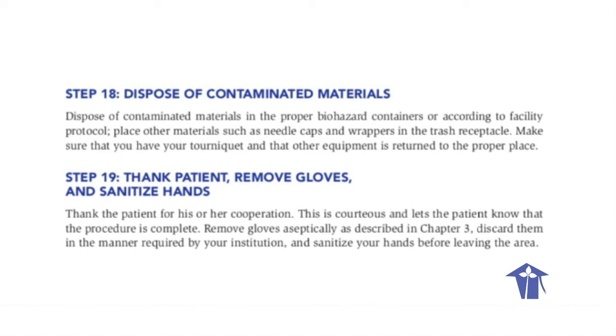Step 19. Thank patient, remove gloves and sanitize hands. Thank the patient for his or her cooperation. This is courteous and lets the patient know that the procedure is complete. Remove gloves aseptically, as described in Chapter 3, discard them in the manner required by your institution and sanitize your hands before leaving the area.